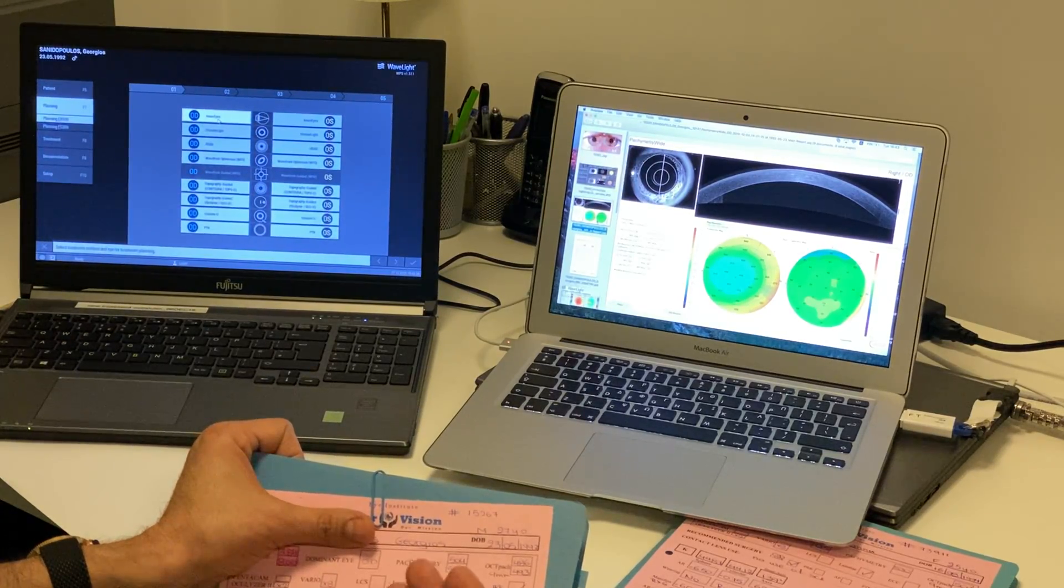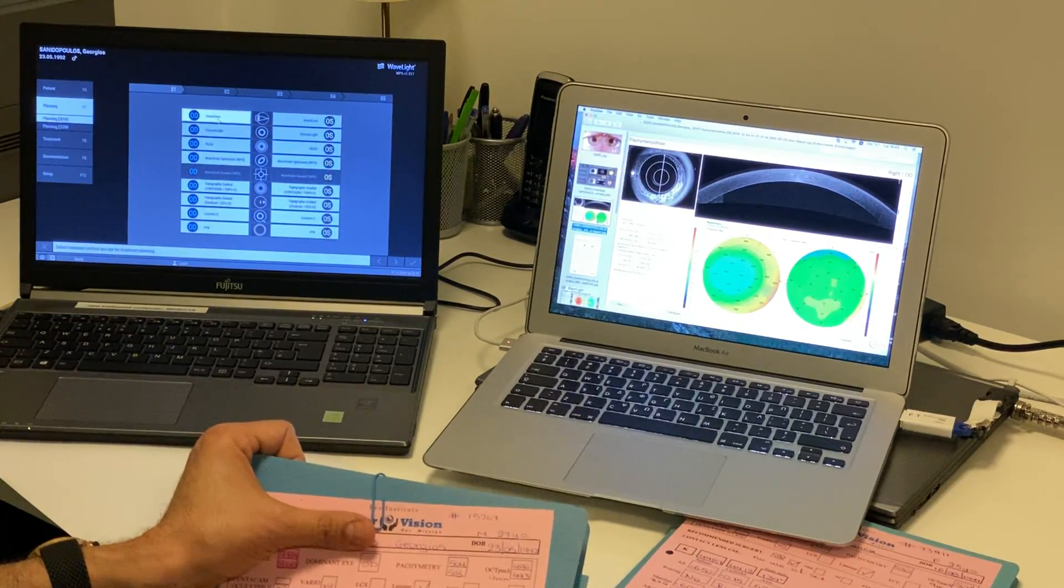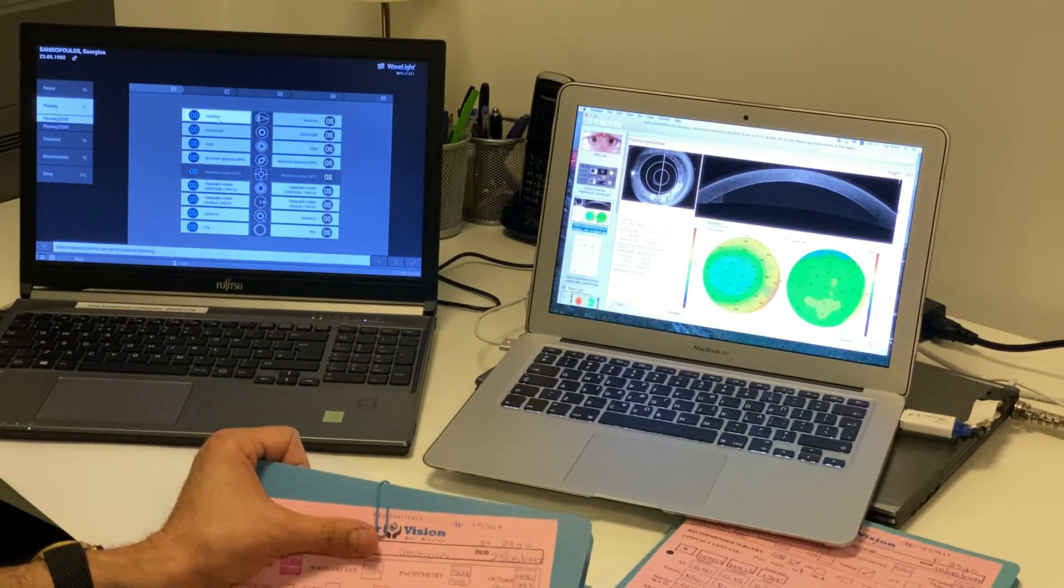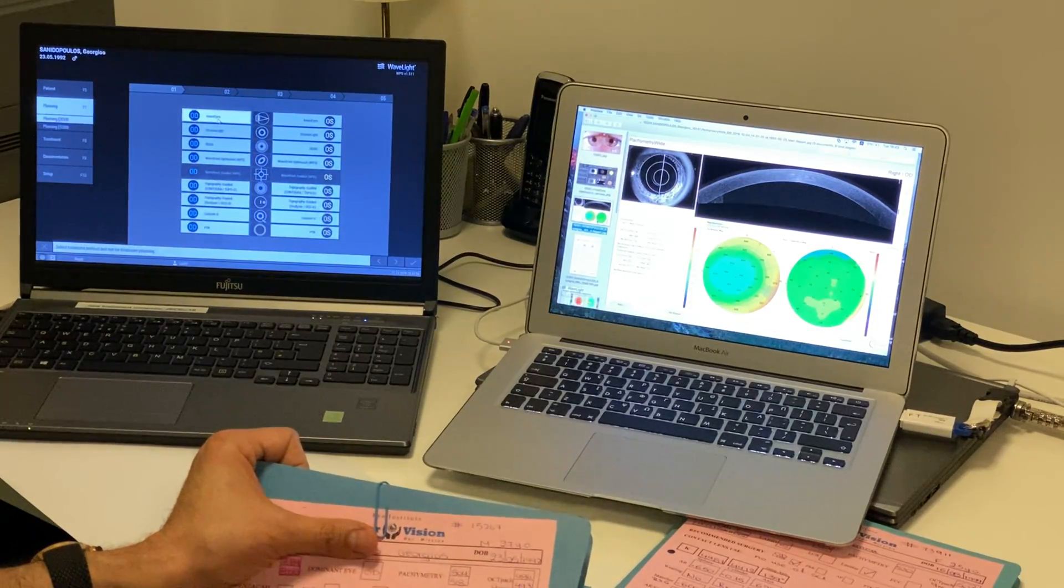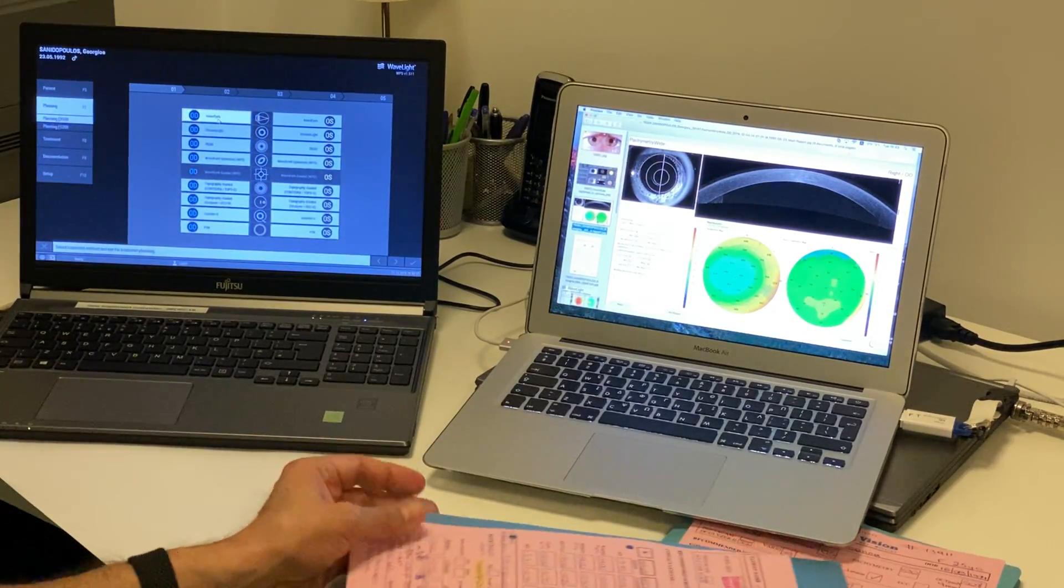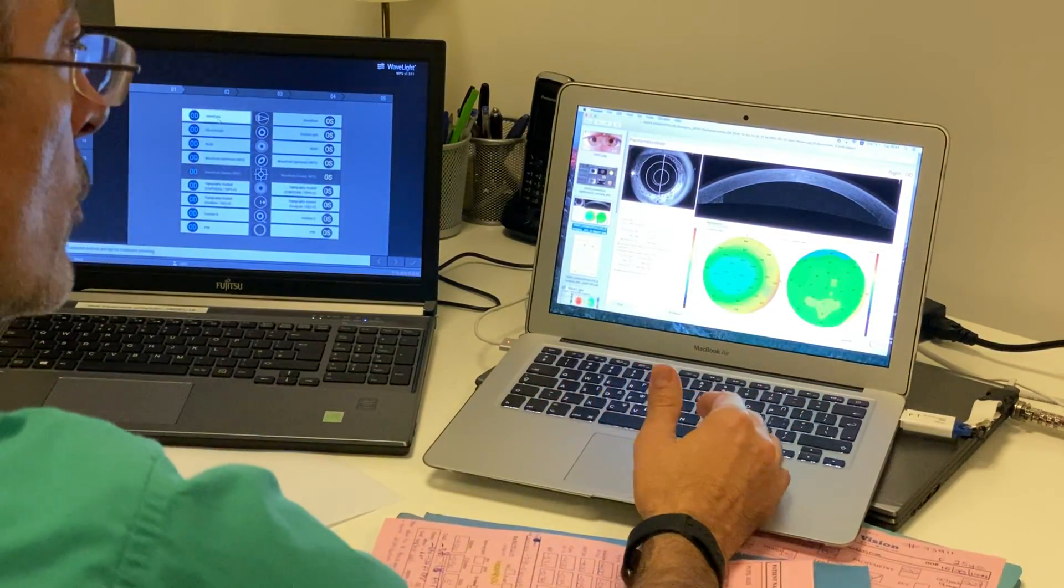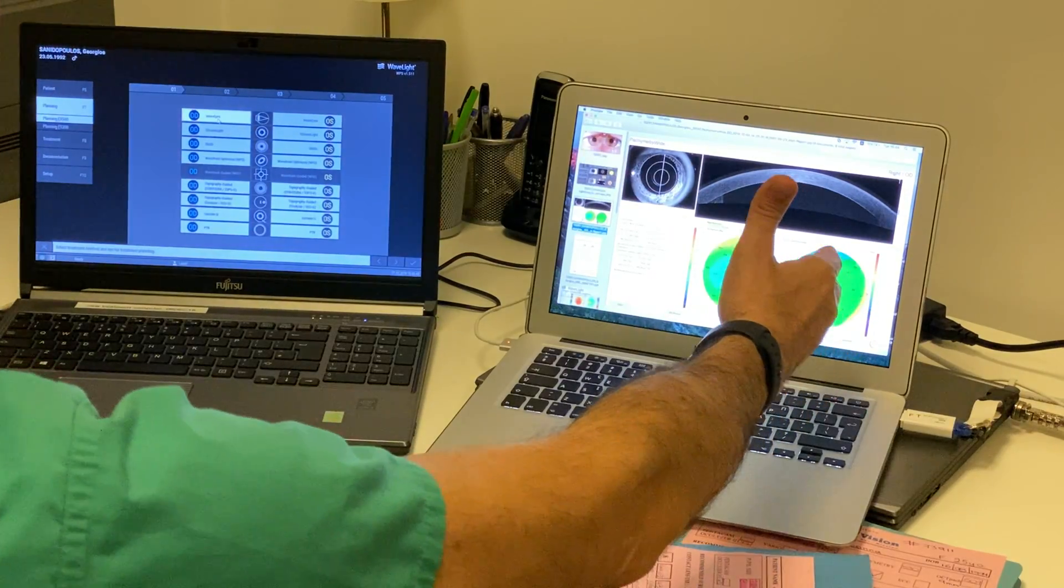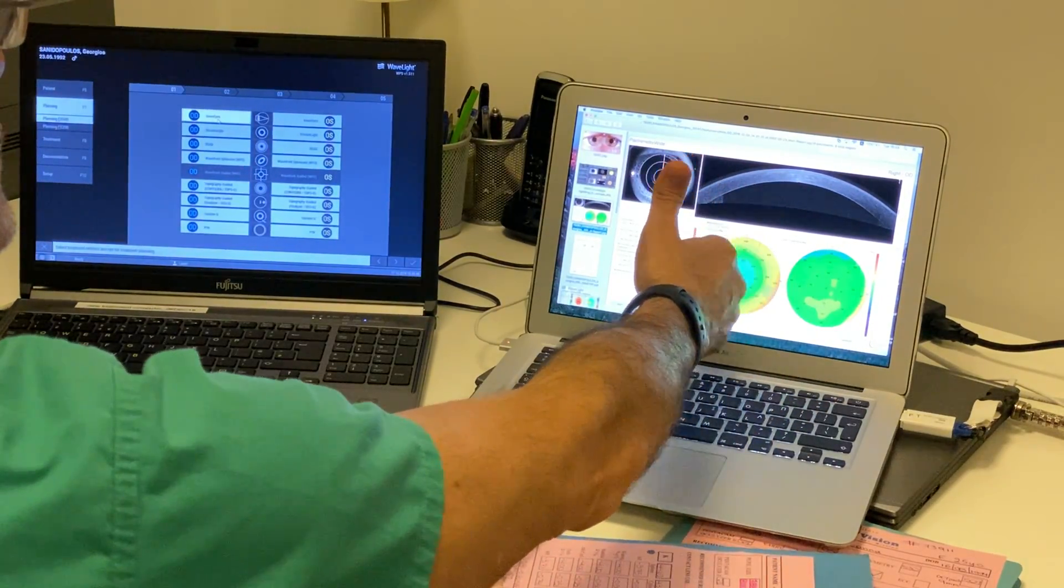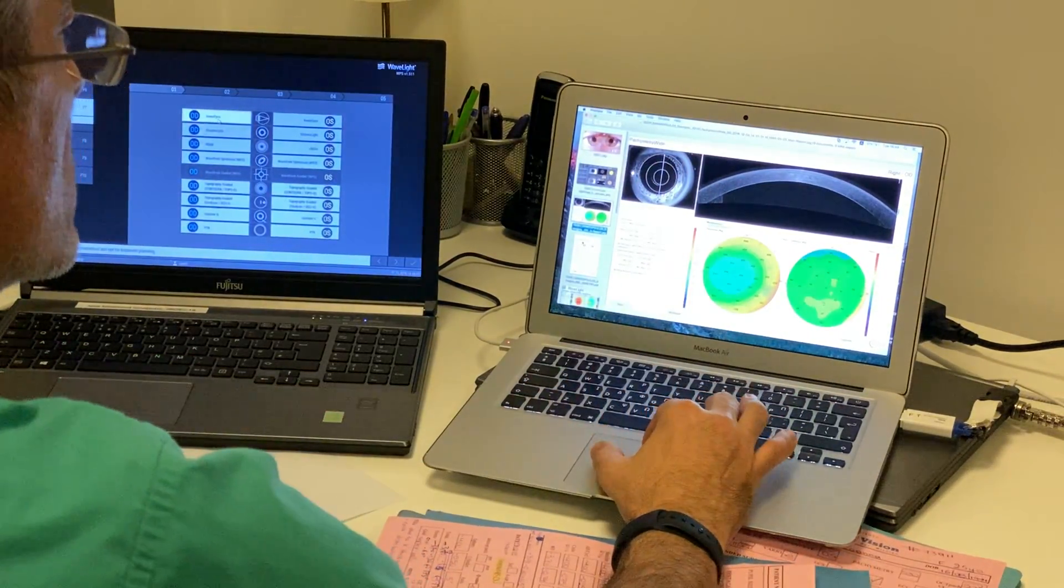We also have the dry manifest, the cycloplegic refraction, several objective measurements with autorefraction and wavefront. And the way we have been working until now is, of course, assessing the cornea normality. This is an OCT image of the total cornea thickness, the epithelial thickness.